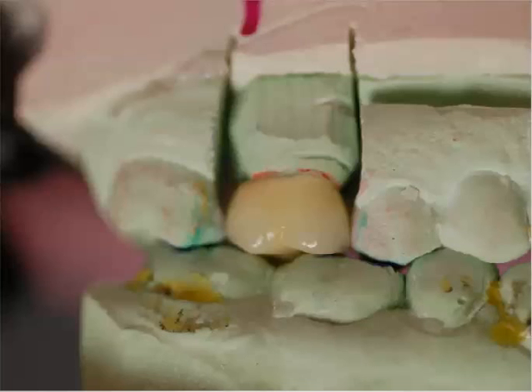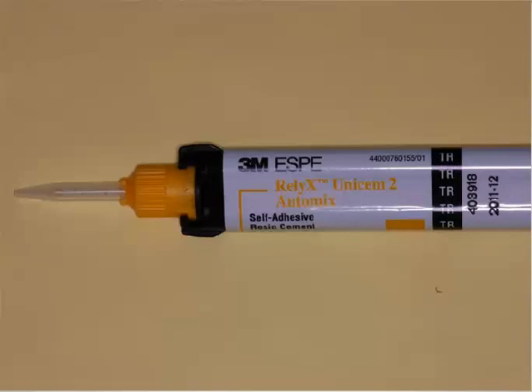I take stone-to-stone models, I hand articulate them, I'll have a bite ridge on this prepared tooth, and now I have the margins I've already defined and marked, send that to the lab. When it comes back, everything should go in without too much frenzy, without too much frustration. So as we put it into place, we have to think, what are we going to cement this with? And there's different materials we can use when we talk about cementing.